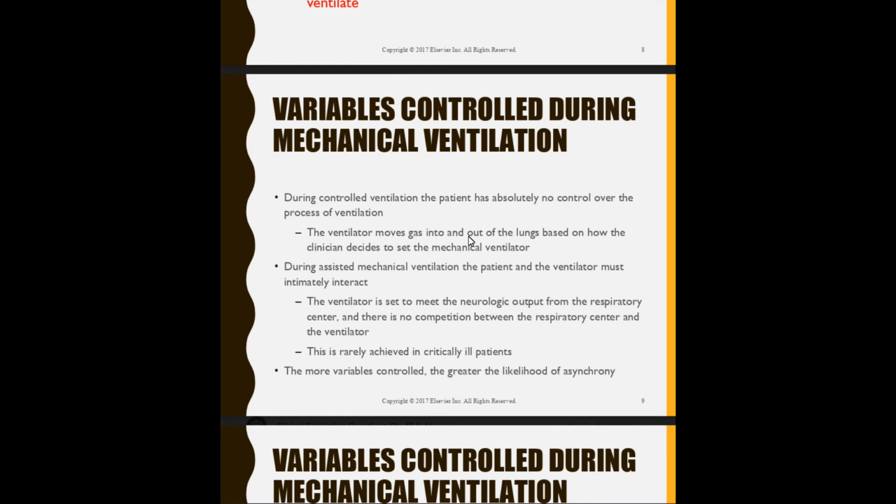Then at least we can start putting them on SIMV and start weaning them off, increasing their muscle strength, increasing their neurological outputs, strengthening the diaphragm to increase muscle mass. Because usually if you're on sedation or you're not using your muscles, you're on AC. Remember, the machine's breathing for you, so you have a decrease in neurological output. Your brain is saying, "Hey, I'm breathing, but I'm not sending the signal to breathe." Oh, okay. I guess we're just going to chill.